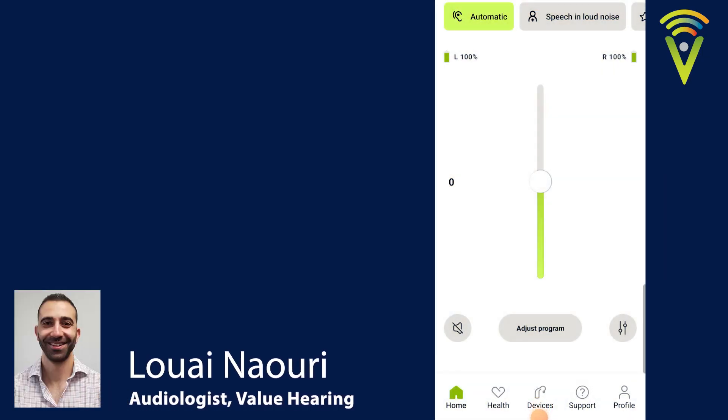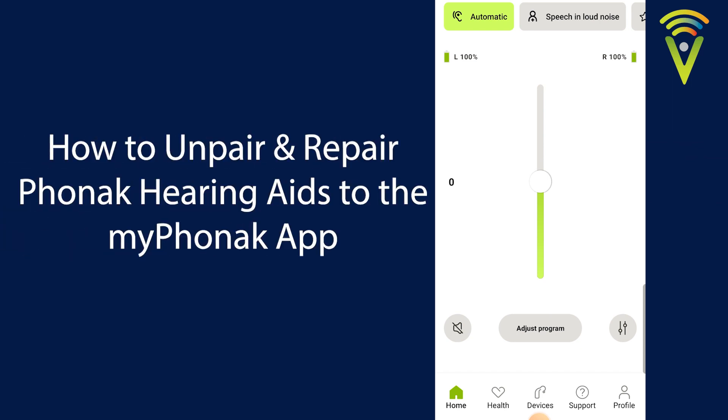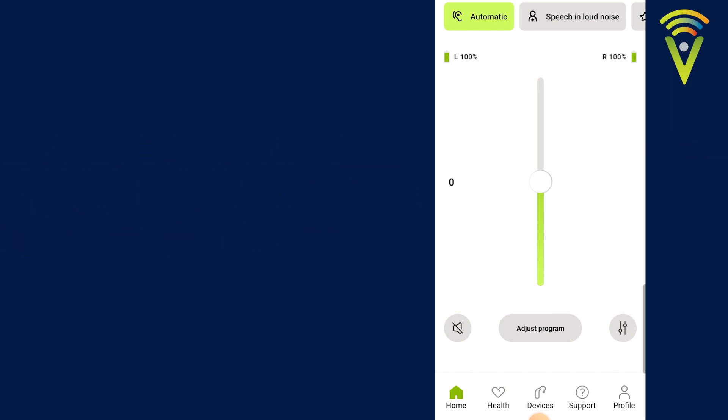This is Louis from ValueHearing. In this video I'm going to quickly show you how we unpair and repair our Phonak hearing aids to the My Phonak app. This is always a good thing to try if you're having some strange Bluetooth connectivity issues with the app.